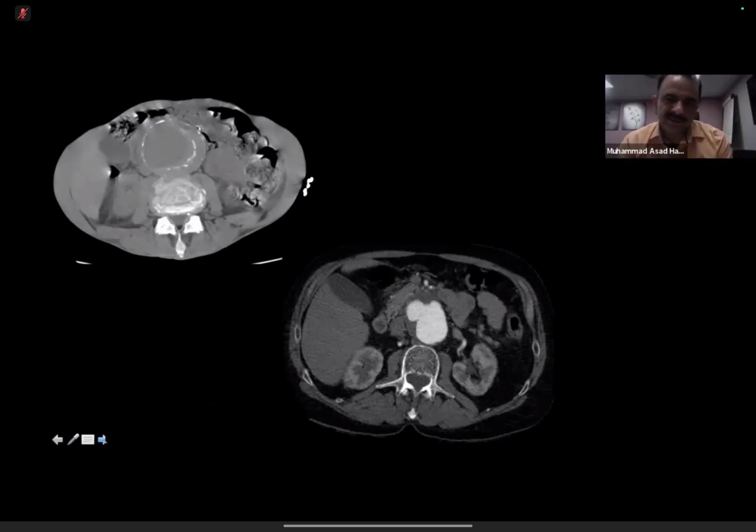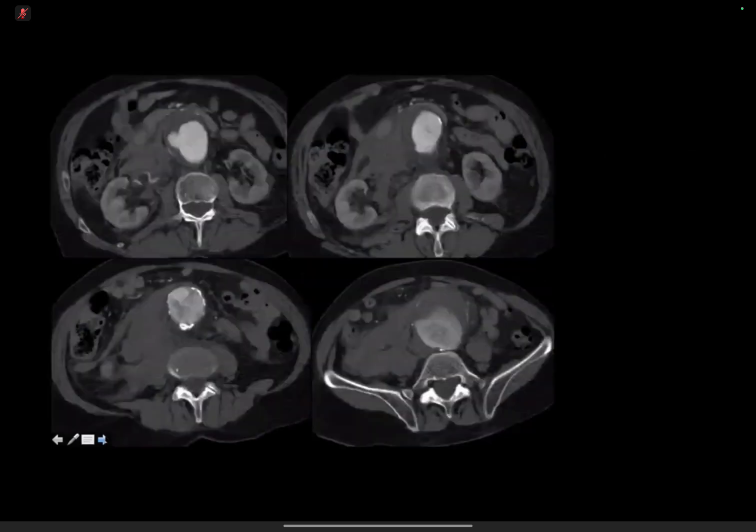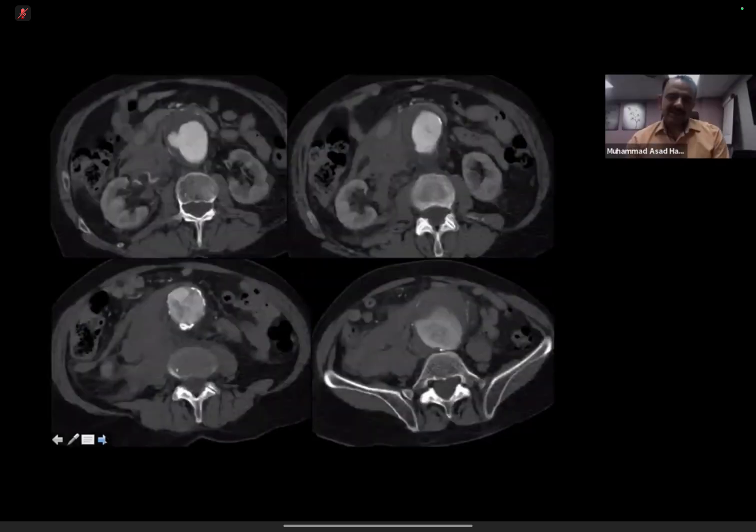Some centers still routinely perform unenhanced images to see if there is any fresh thrombus within the thrombus, as you can see in the image on the upper left corner. And again, if it suggests the fresh thrombus is going through that, and there is basically dissection of the wall, then again, these aneurysms are likely to rupture. Okay. Now, this was not highlighted as impending rupture.